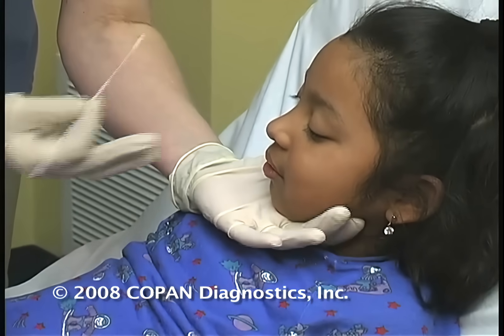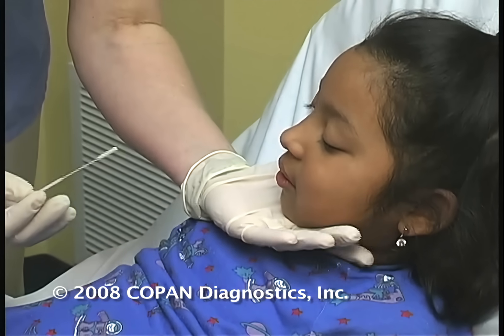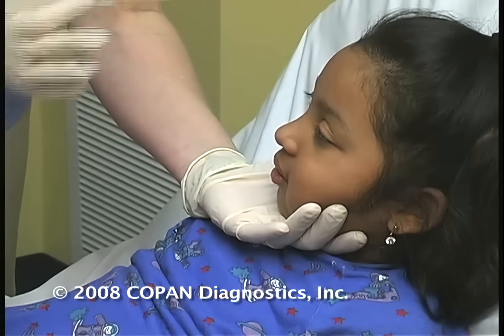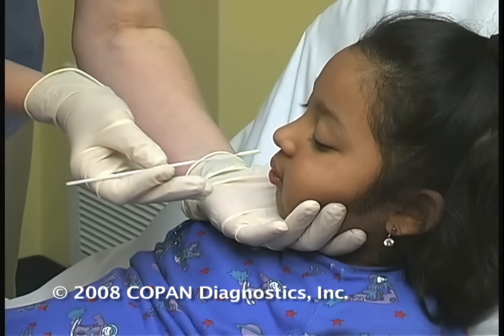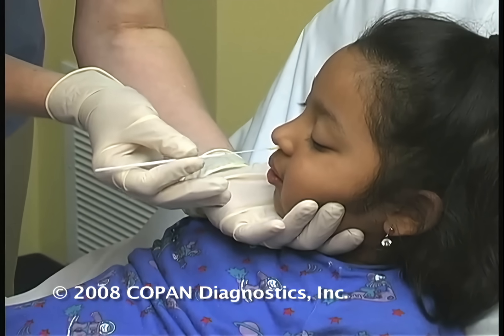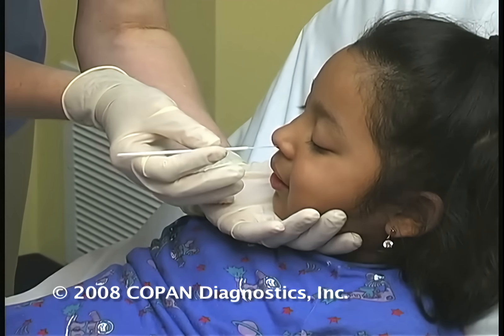You can notice that I tend to hold and just kind of gently support the child's chin so that they don't move a lot when you're doing the swab. Now, she's going to feel just a little bit of tickly — you feel that tickly right there, Yadira? So it's going to tickle.